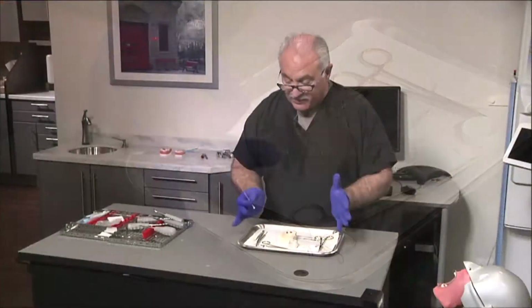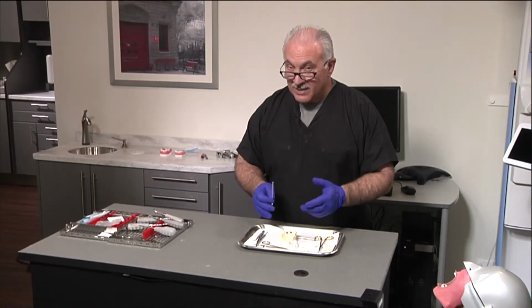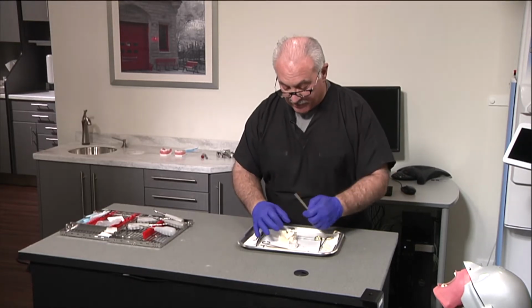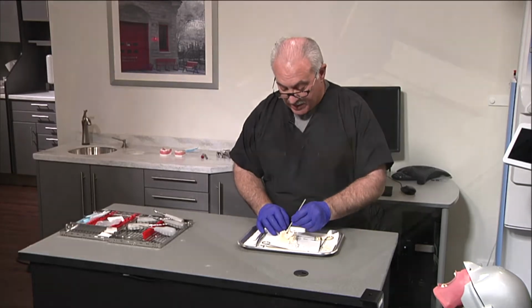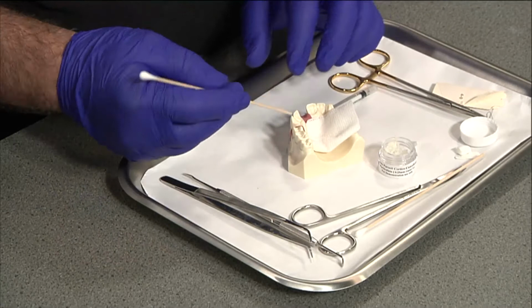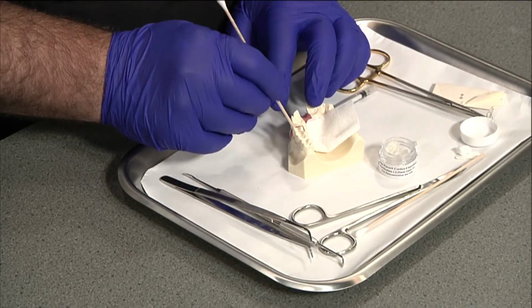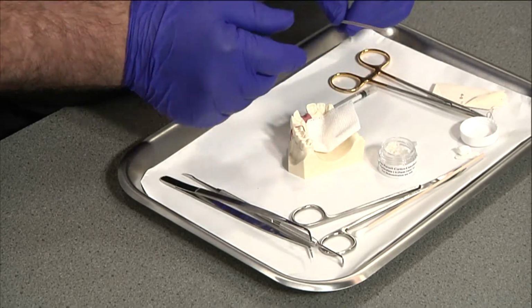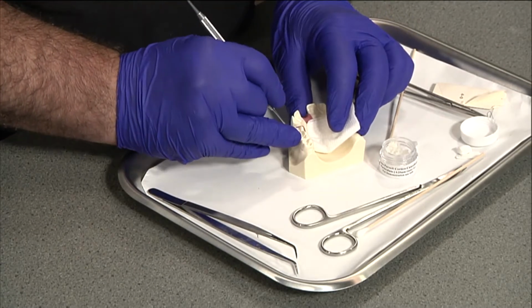When you're at this step, suction is off because you don't want the assistant to inadvertently aspirate the graft. So we'll have 2x2s and 4x4s draping, and also readily handy are cotton tip applicators to get saliva and ooze. Then you can use the wood end of your cotton tip applicator. Surely check first to make sure there are no splinters. And then you condense it to the level of the bone.